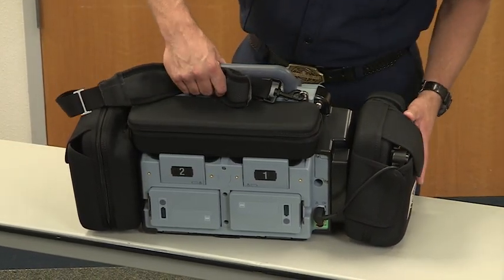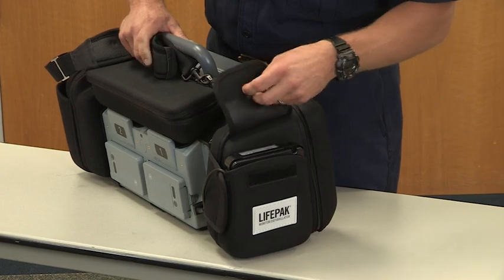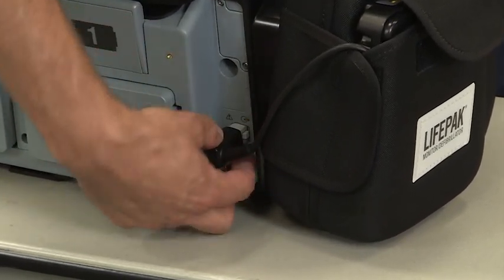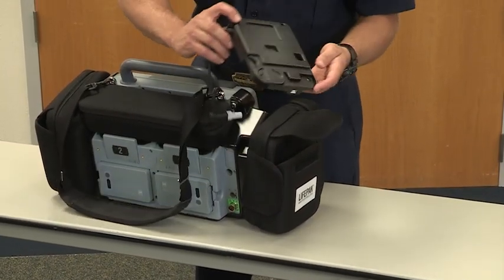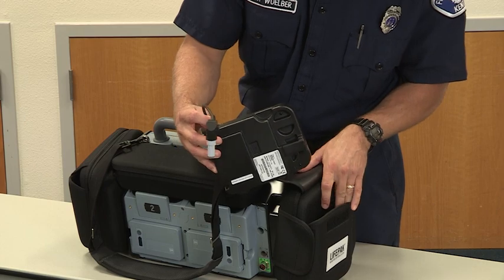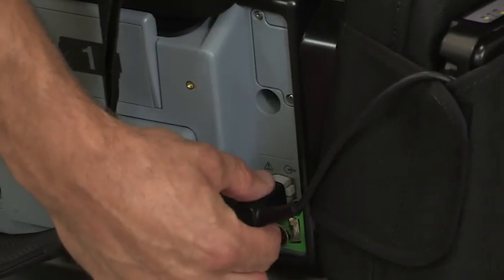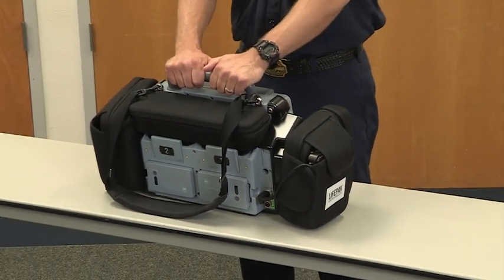One of the other checks we'd like you to do is just do a cursory check of the Gateway Titan wireless router for any cracks or chips on the corners or things like that. We also want to be sure that the pigtail is plugged in firmly in the back of the machine. Now I'll take the opportunity to pull this out for you guys to show you what this looks like. It's just a simple wireless router that's tucked into the pouch on the side of the case here, and just, as you can see, plugs in the back. Again, be sure every morning that that pigtail is plugged in firmly and connected. That ends our daily check.